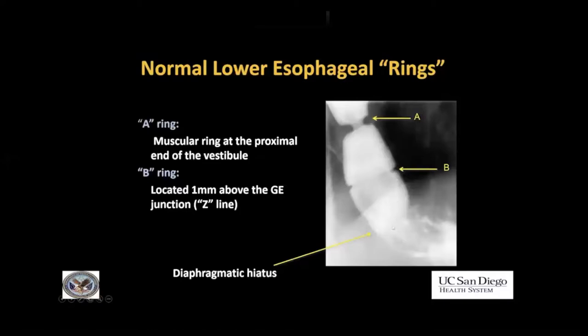The B-ring usually should be right at the diaphragmatic hiatus. You usually don't see it that well unless there's a hiatal hernia, like in this case. This whole area is hiatal hernia as the stomach is pulled up. We know the Z-line should be just below the B-ring, so all of this is stomach. You usually only see the B-ring this well when there's a hiatal hernia. Be aware that the diaphragmatic hiatus where the GE junction is normally located will be quite a bit below the diaphragm, because these images are always performed obliquely. So when performing these esophagrams, make sure you go low enough — don't stop at the diaphragm; go all the way down to the diaphragmatic hiatus.